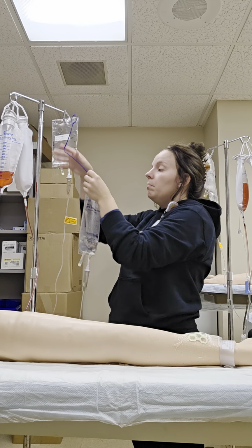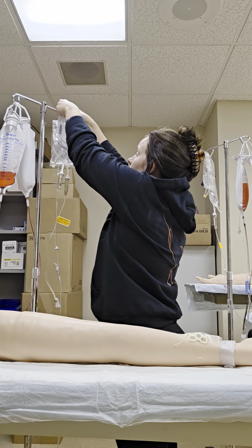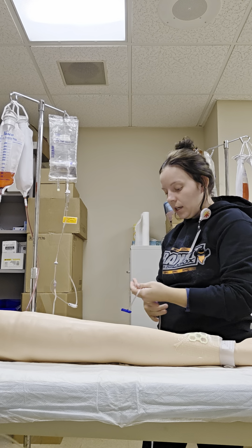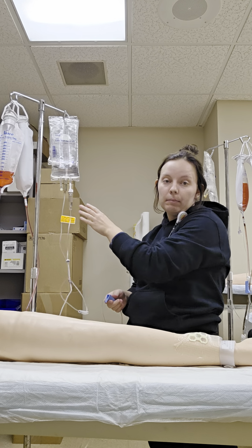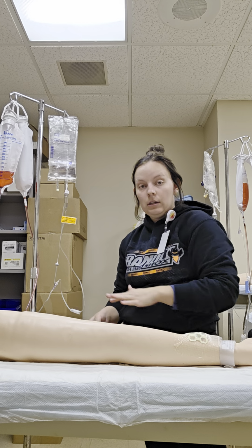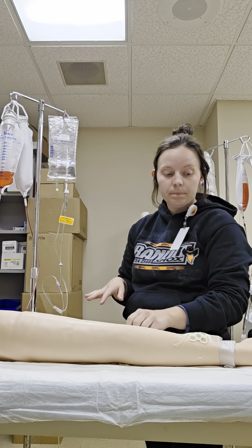I'm going to go ahead and put my primary bag back up here. Primary bag is hung back up. And then I would go ahead and ensure that I'm putting my flow rate back on my primary tubing to the way it was. So flow rate is correct for the primary tubing.